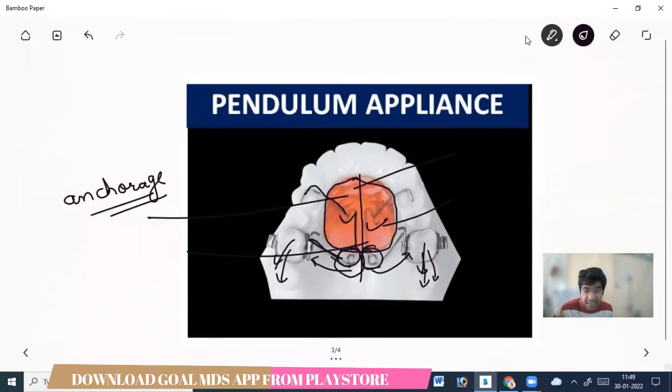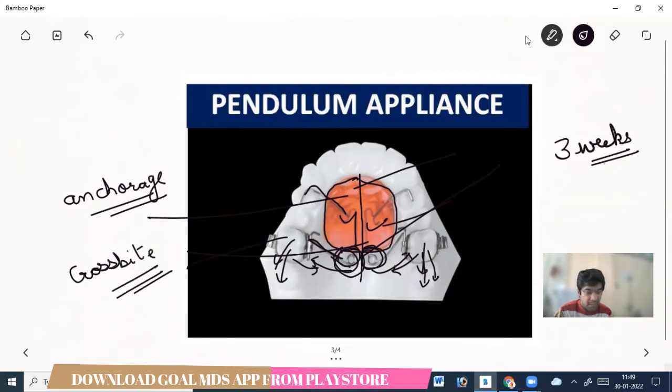There is a readjustment of springs, remember, every 3 weeks. As the molar moves distally, the force of the springs will cause the molar to move in an arch toward the midline of the palate. That could lead to a cross bite in the posterior teeth. So in order to avoid this side effect, we make adjustment loops to counteract this medial movement of the first molar.